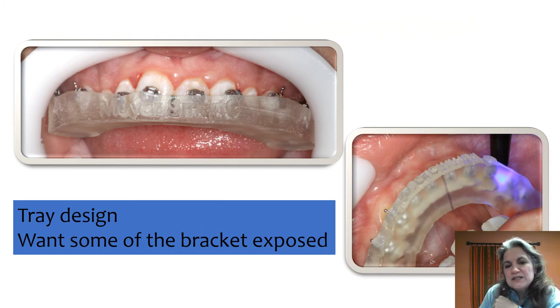When you look at tray design, you want to be able to see some of the bracket. It makes it easier to cure, it makes sure you can see that brackets are completely seated when loading, it lets you visualize brackets as you're seating the tray, and it makes the tray much easier to remove once you're done with your final cure.